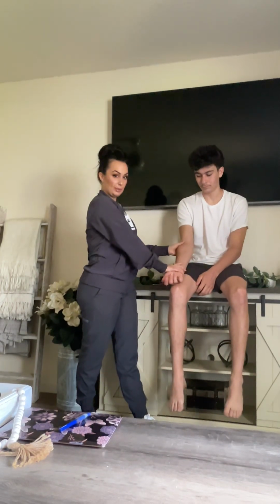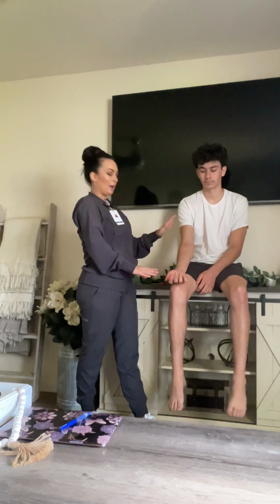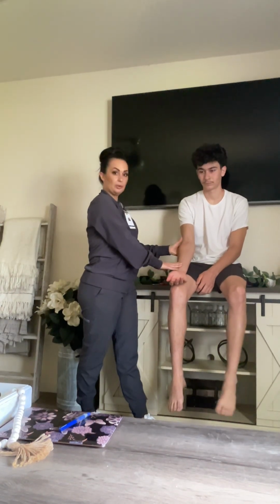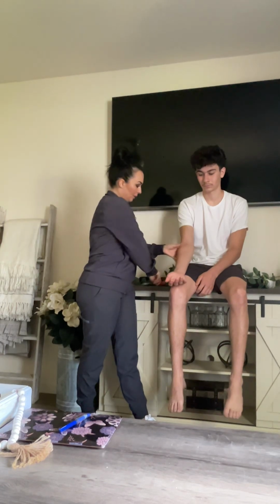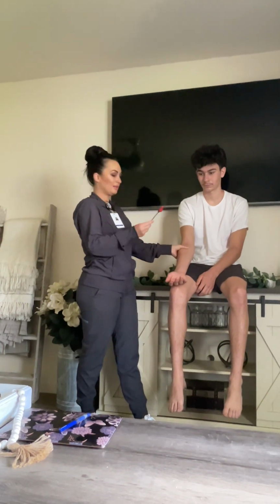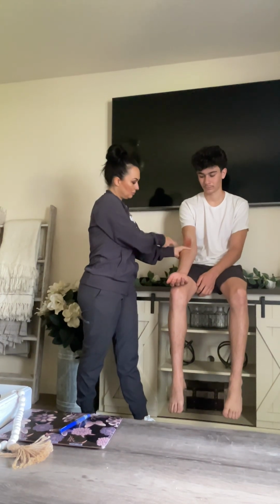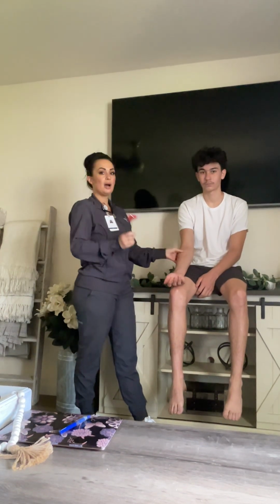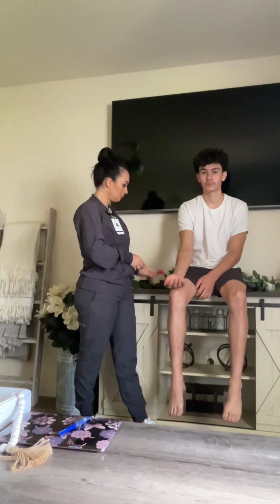So we're gonna make sure that the patient has their arm right in front of them and completely relaxed. I'm going to be supporting the patient's elbow. With one hand, I'm going to place my thumb over the tendon and then tap it right above. And this is going to be with the pointed side. Okay. A normal response is a slight movement in the forearm, which we did see here.